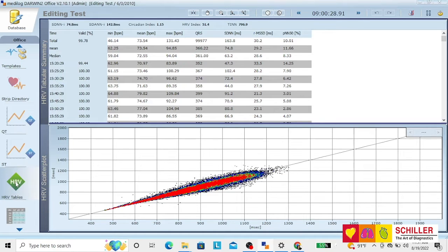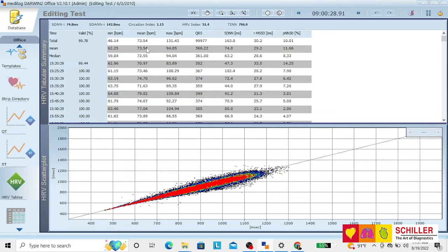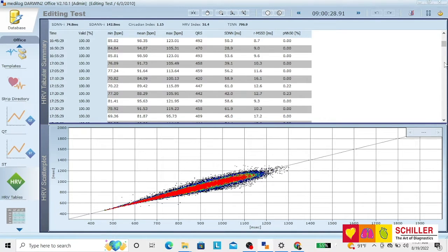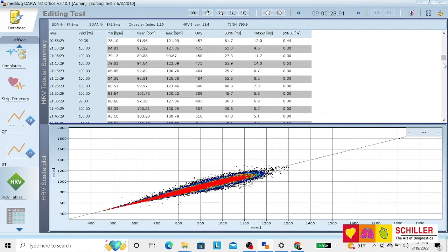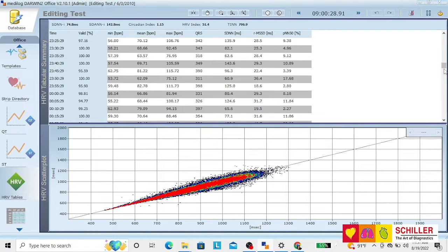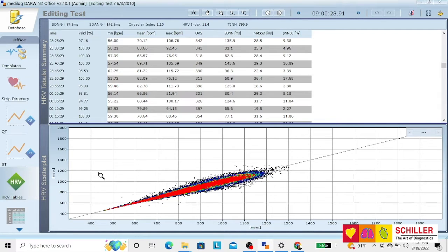Heart rate variability on time domain. You have the full table. Directly, you can see here it is every five minutes by programming, and you will have your Lorenz plot on the dispersion of heart rate variability.